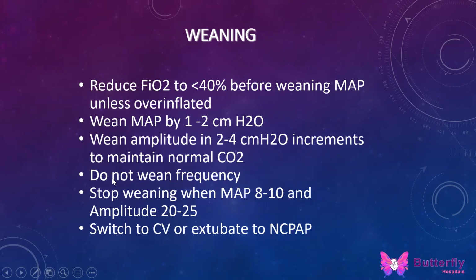Frequency is something that generally we tend to avoid adjusting, but frequency can sometimes need to be adjusted, particularly for babies who have prolonged ventilation or are very difficult to ventilate, with difficult carbon dioxide clearance, like babies with BPD, PIE, pulmonary interstitial emphysema, congenital diaphragmatic hernias, babies with hypoplastic lungs. These are quite difficult to ventilate. You might want to adjust the frequency for these babies, but generally frequency remains untouched.